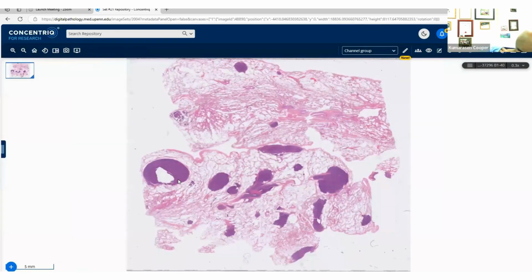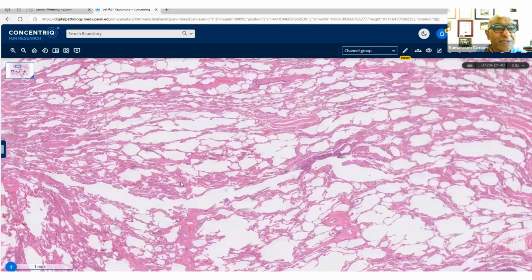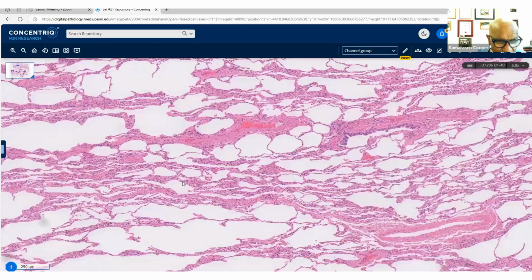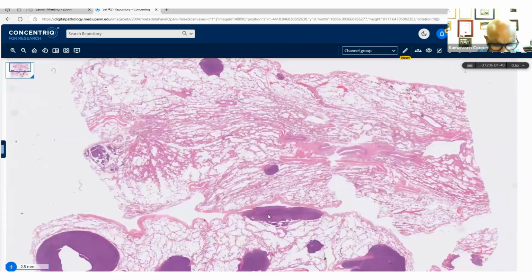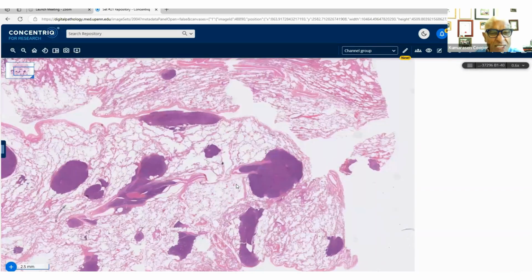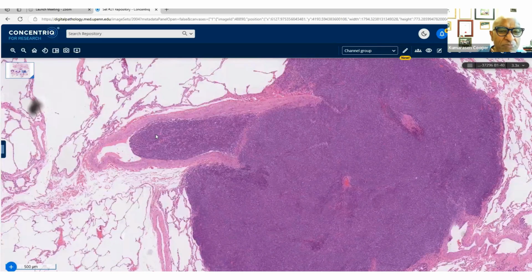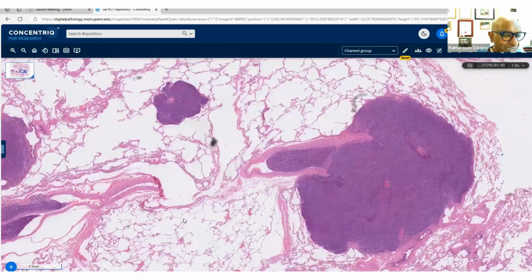Okay. So this, you can all recognize, is a 44-year-old woman, and you can all recognize the lung tissue in the background. So this was a lung wedge resection. And then you have these nodules here. Some of them are in the parenchyma. I'm just going to show you the distribution. Wow, look at this one. This is literally either breaking out or breaking into this vessel. Okay, we'll go and look at the morphology. It's hugely cellular, very, very dark.